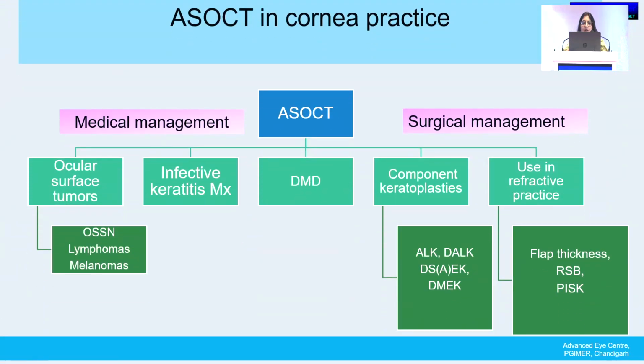Coming on to the second part of my talk, I'll talk about AS-OCT in corneal practice. So AS-OCT and Swept-source is a part of the OCT family. So in some situations, it would show more benefits, but otherwise it would be the same as other OCTs. And we can use it for medical management as well as surgical management. I'll just run through a few case scenarios.